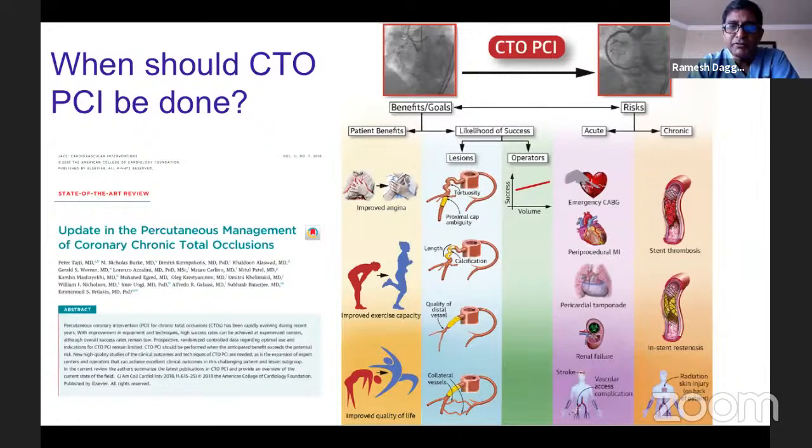My last CTO for an RCA, with a guy who had a kidney injury, used about 35 ml. So we need to be cautious in how we use contrast, and we should consider contrast as a poison for these patients.